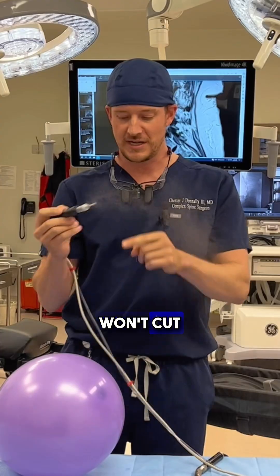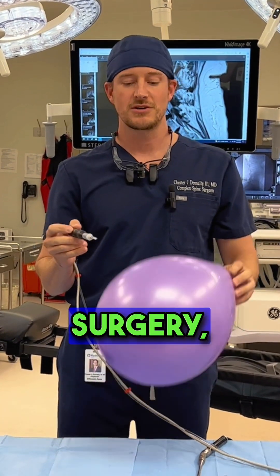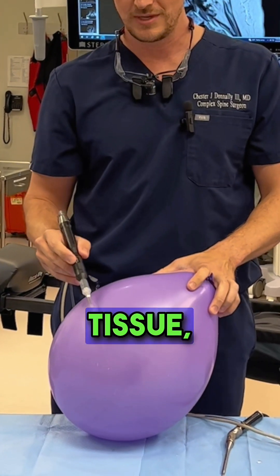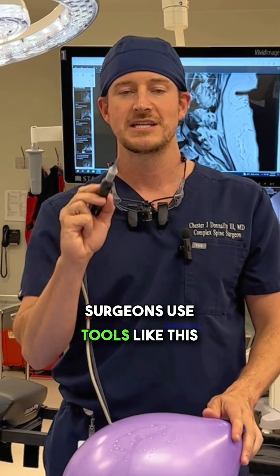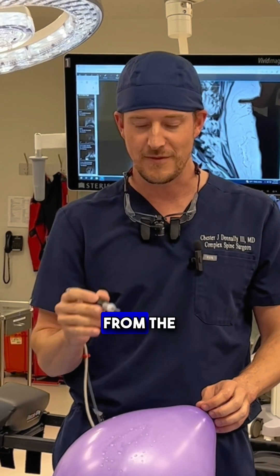This is on my finger — it won't cut tissue. The reason that's important is when we do spine surgery, delicate things such as a balloon, nerves, tissue, it won't cut. I'm doing this on the outside of the balloon. The reason spine surgeons use tools like this is it takes the bone spurs, it takes the arthritis away from the nerves.